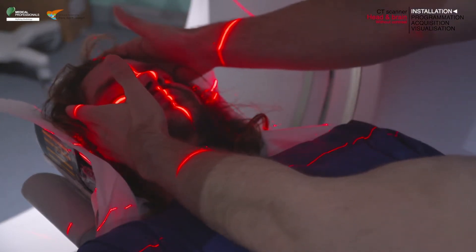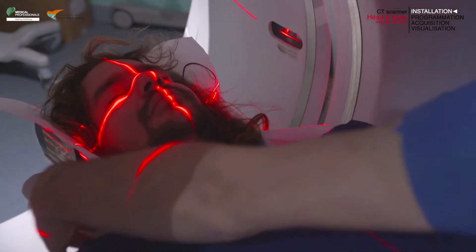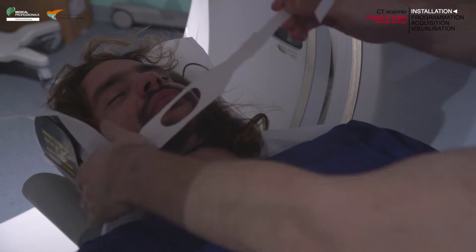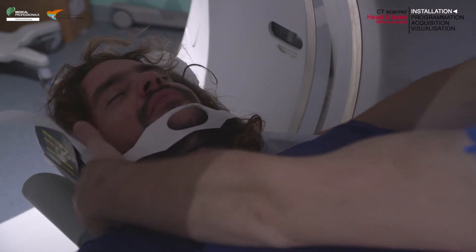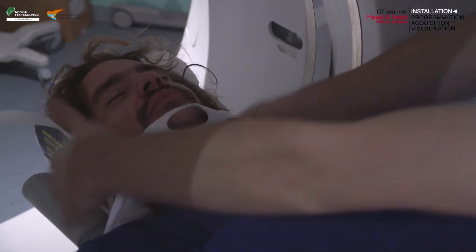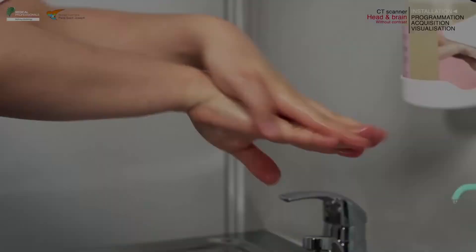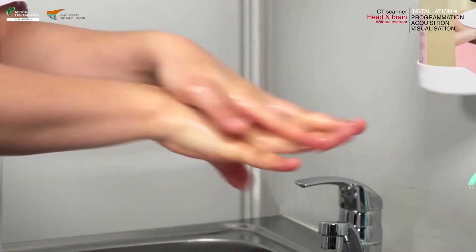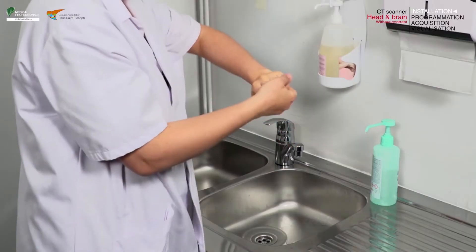To help your patient maintain the position, you can place a restraint strap on their chin or forehead. Remember to close the doors of the examination room and perform proper hand hygiene, such as a rub with an alcohol-based hand sanitizer.